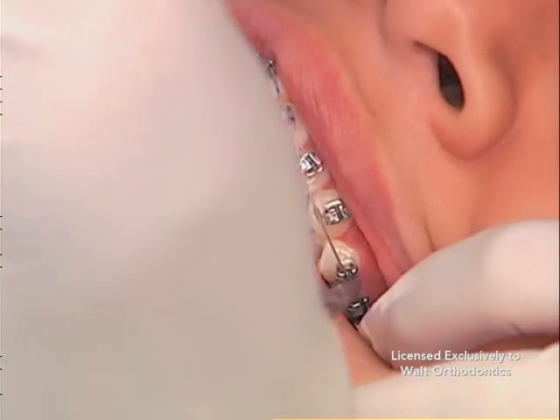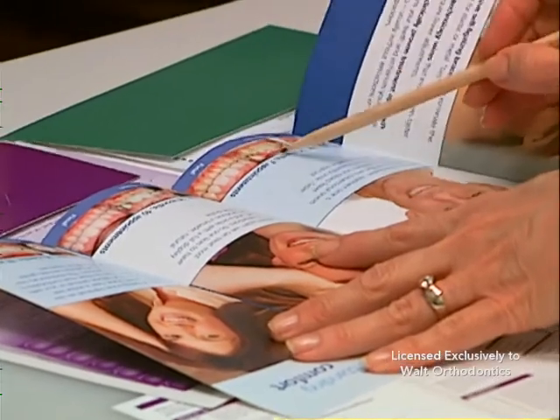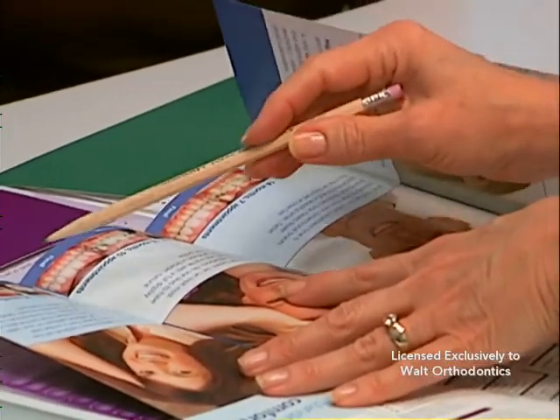Your braces will go to work immediately. Be sure to follow all of the guidelines and instructions for care of your new braces, as patient compliance is a critical component to a successful outcome.